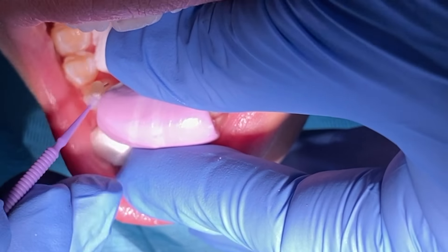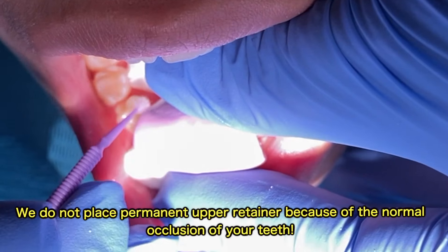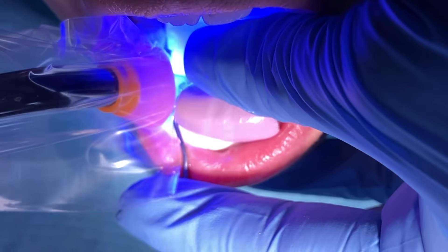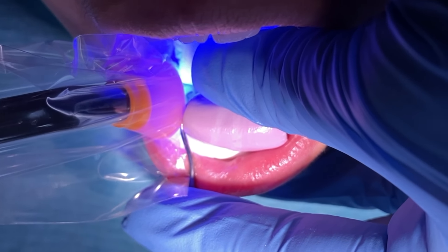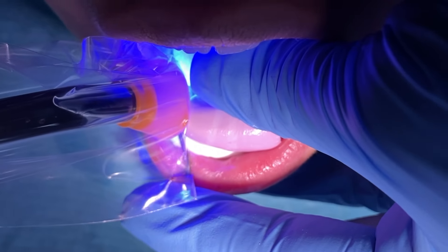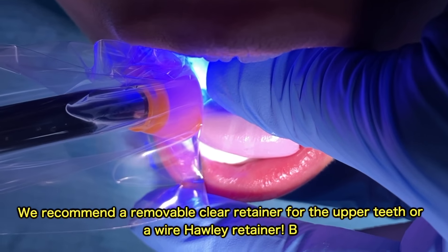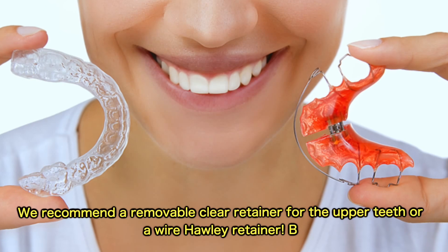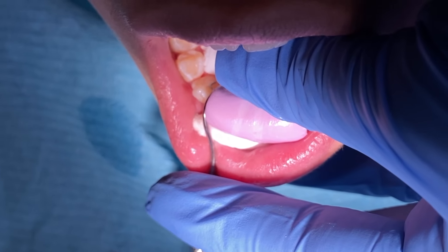We get asked a lot around here why we don't bond a permanent three-to-three retainer on top. The reason being is because of the occlusion — the bite. Whenever you bite down, your bottom teeth will knock off the top retainer, causing trauma to your bottom teeth, chipping, and then you lose your retainer on top. So what we recommend is a clear retainer, or you can get a removable one which is called a Hawley, and it has a wire retention on it. That one you can use during the night or during the day — both are very beneficial.